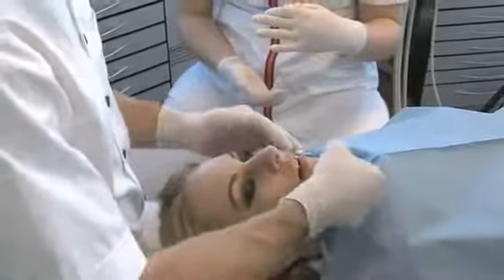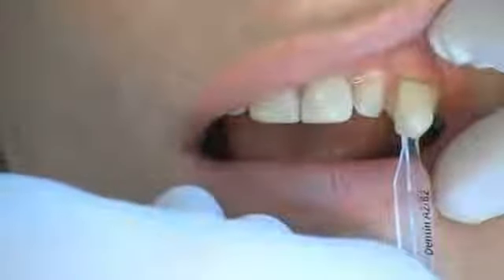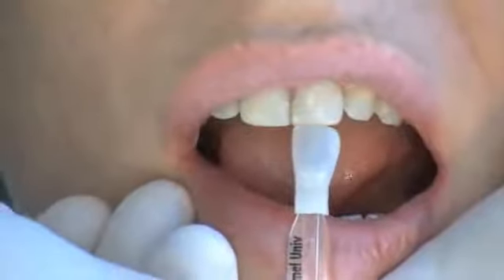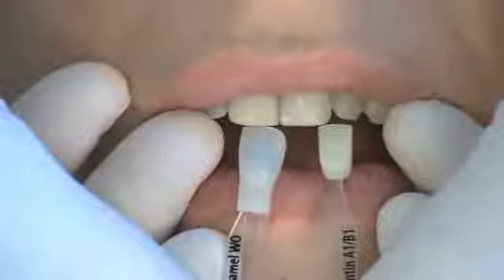Before the preparation, the dentine and enamel shades are determined cervically and incisally respectively on the teeth using the shade guide. The interplay between dentine and enamel can be determined by placing the shade guides on top of each other.